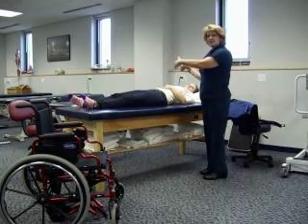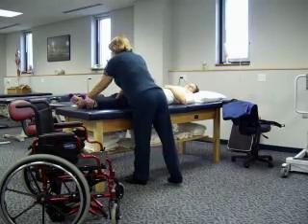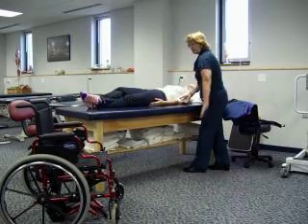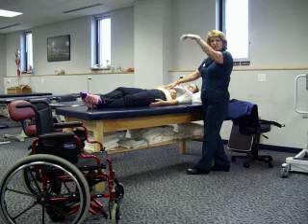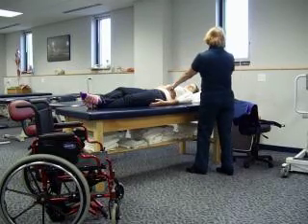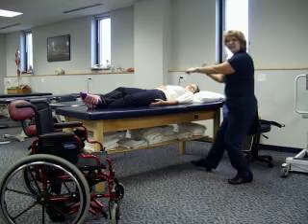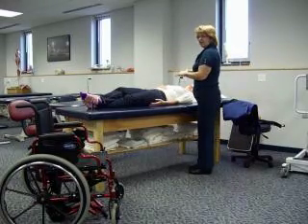To roll her onto her side, I made sure she's over to the side a little bit so she has safe distance. I'm going to take her foot and cross it over, supporting under the knee, with the upper leg on top since that's the direction she's rolling. Her hand closest to me I'll put down, almost tucked under her with the thumb upright — more comfortable for the rolling process. The other hand I'll support on her abdomen. My hands are going to be on the hip and on the shoulder, not on the arm and the leg. I should be shifting weight, not moving my back or arms.